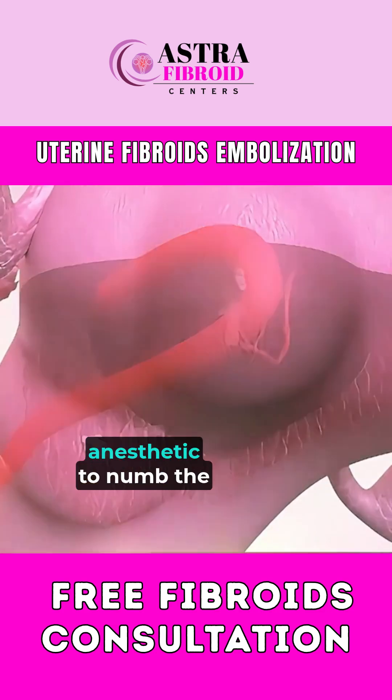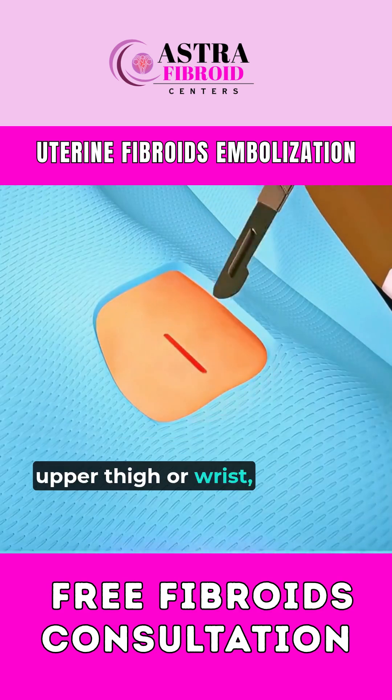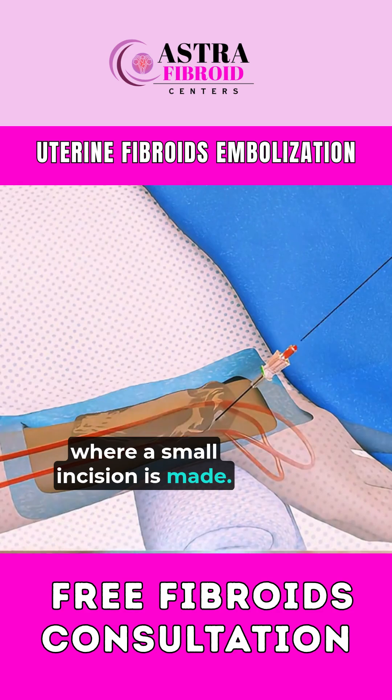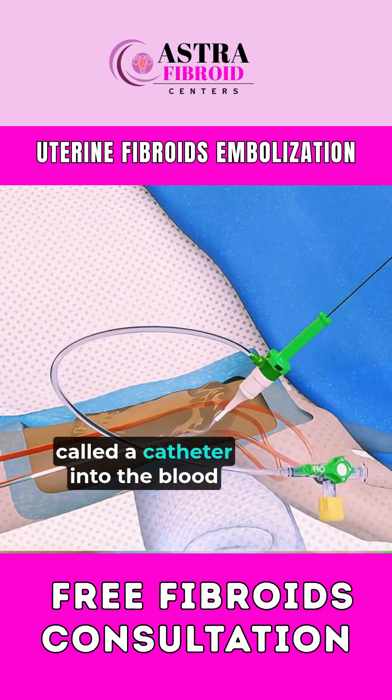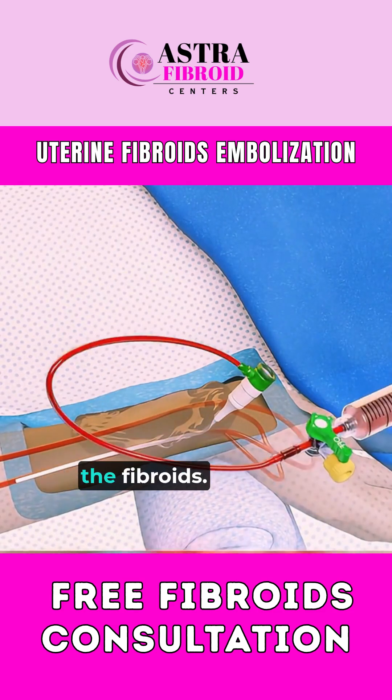The patient receives a local anesthetic to numb the upper thigh or wrist, where a small incision is made. Through this tiny opening, the doctor inserts a thin tube called a catheter into the blood vessels that supply the fibroids.